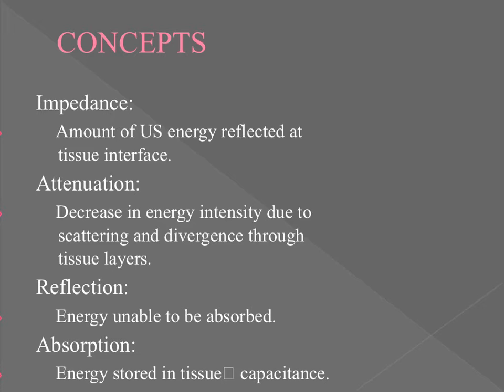But sometimes in ultrasound, that kinetic energy might not be transformed into heat. It might actually be transformed into things that cause healing, fibroblastic repair. And we'll talk about that when we get to non-thermal. But the ultimate goal, you guys, for therapeutic ultrasound is absorption. We just have to get through tissue impedance, and we have to figure out how much is left after some of the energy has been attenuated.